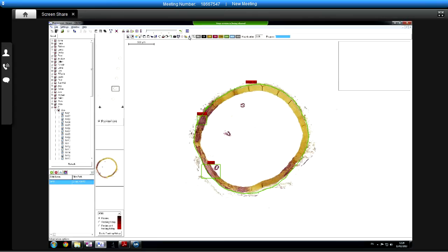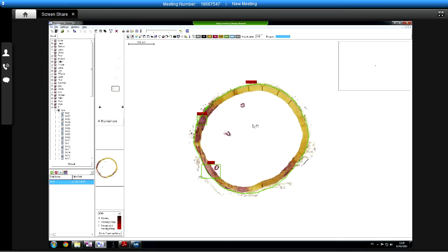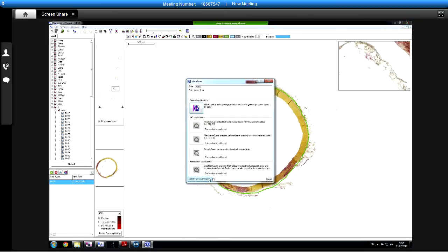Did I run the right algorithm there? No. I ran your cell counting and funny enough it's found no brown positive cells on there. Well, that's good to know. Yeah, it's a result. Your sample is not at all positive for the wrong type of cell. It's good to know it's not brain.